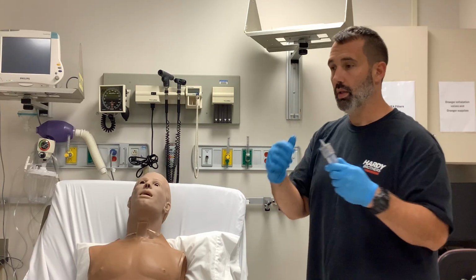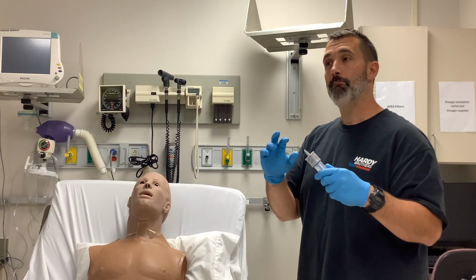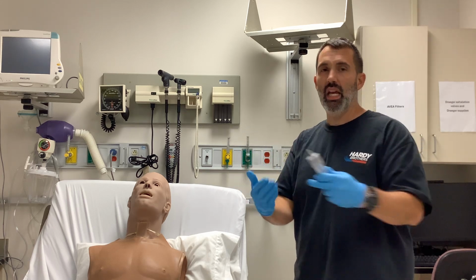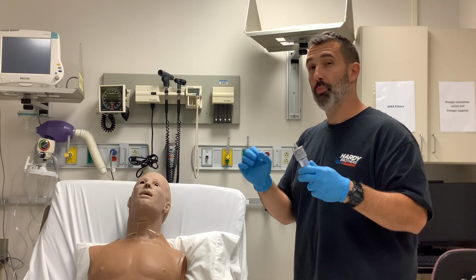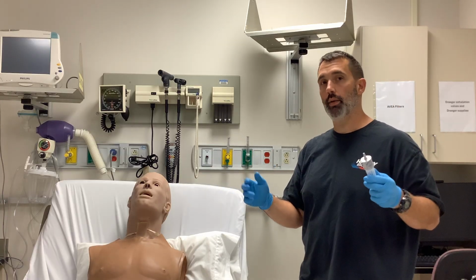And I'll provide you with a clinical scenario that I encountered as a respiratory therapist that, I'm glad I was there to witness it because it became a teachable moment, but also it could have been a pretty rough time for the patient that was attached to the system later on had nobody called it when it had occurred.